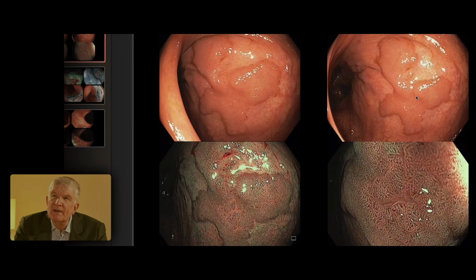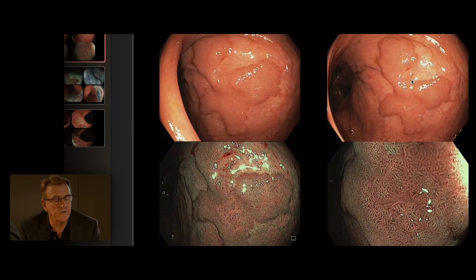And this middle thing there at the margin? It's a little scar. It's possibly a site of previous resection, but you can't be sure. Depends on the honesty of the referrer. And also when you start to resect the lesion, that can inform the process.